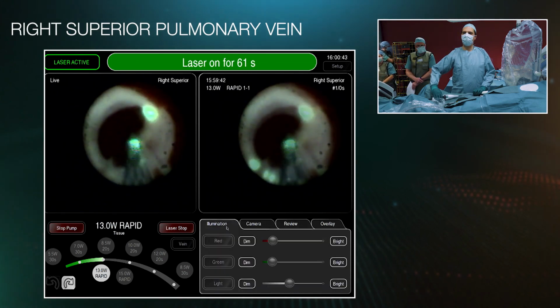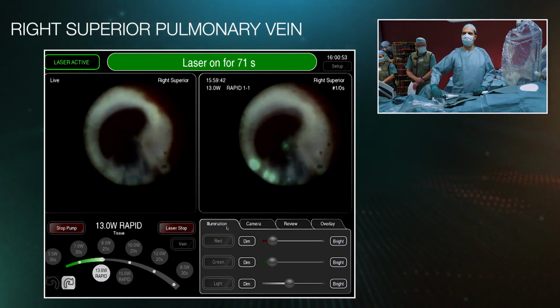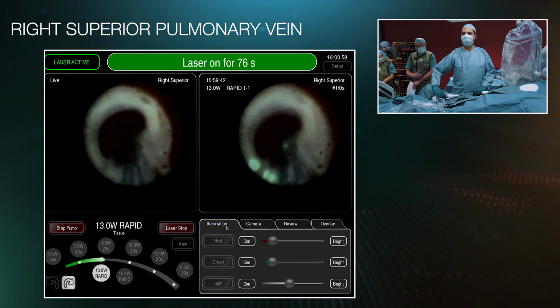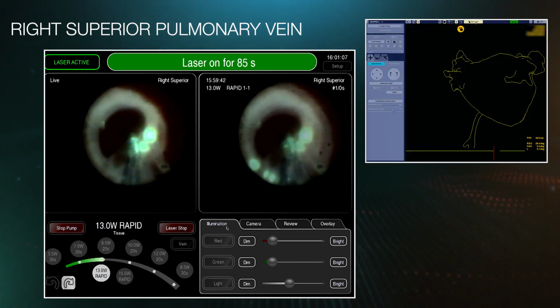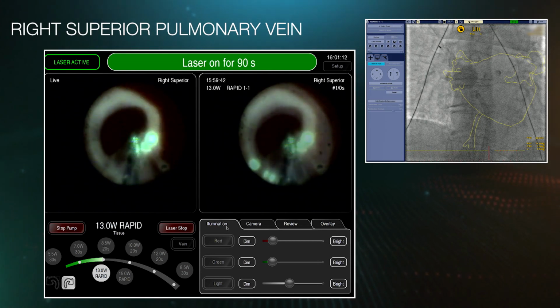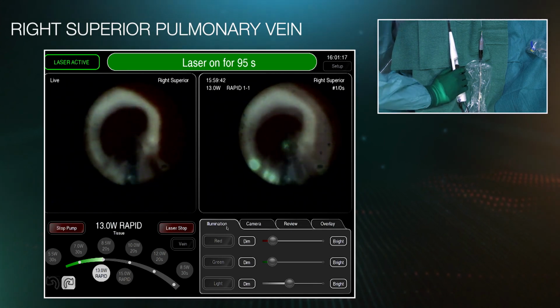You see we're touching the edge of the blood pool here. Sometimes for a tiny second the laser target changes to red at its edges. If this would become worse, I'd have to stop here and do something about it. But fortunately we've passed this region now and we can simply continue. On the X-ray you can appreciate our very proximal position, so it's a very safe position in terms of phrenic nerve damage. And here we're going to go under the blind spot, so here is where I want to stop.